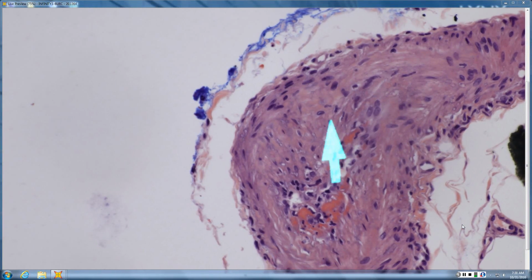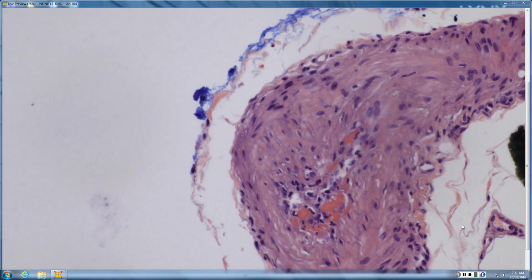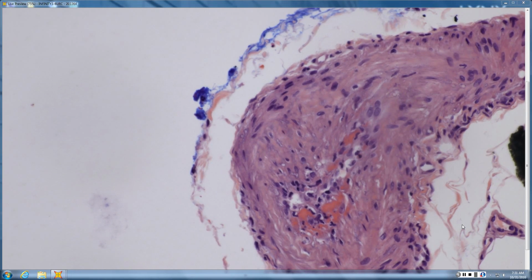The other one to throw in, if you have arteries and veins and the inflammation, here there is a little bit in the wall that you can see. But if it's entirely in the clot, that's what you see in Buerger's. Young Indian male, classically young Indian male, sitting with his stump on the side of the bed, chain smoking, would be like the classic picture of Buerger's.